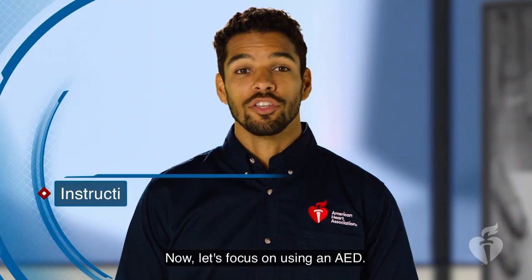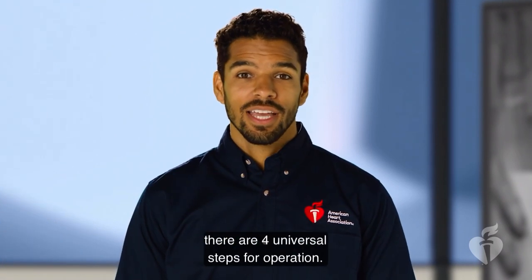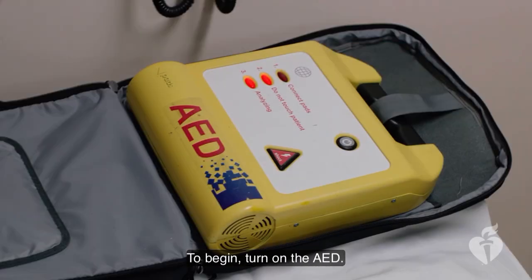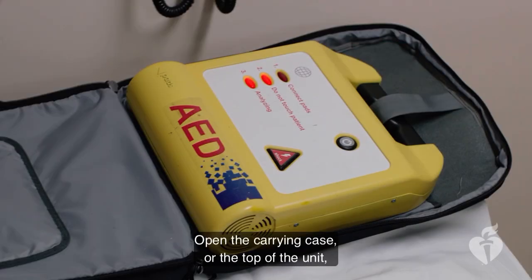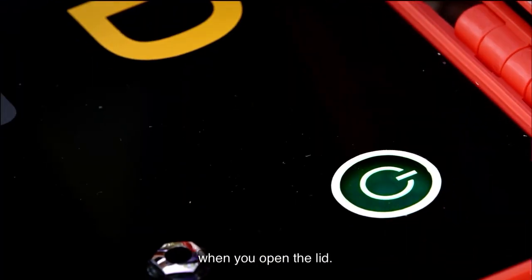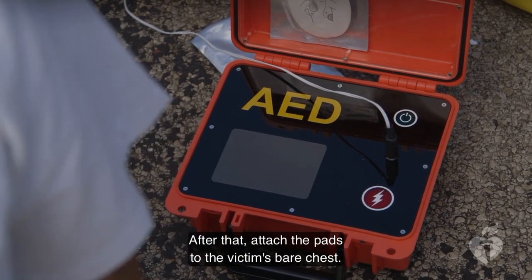Now let's focus on using an AED. Although AEDs may differ slightly, there are 4 universal steps for operation. To begin, turn on the AED. Open the carrying case or the top of the unit and immediately power on the AED. Some devices will power on automatically when you open the lid. After that, attach the pads to the victim's bare chest.